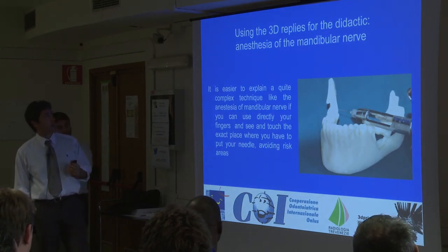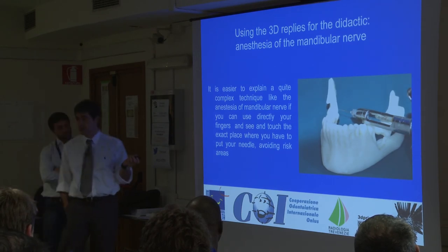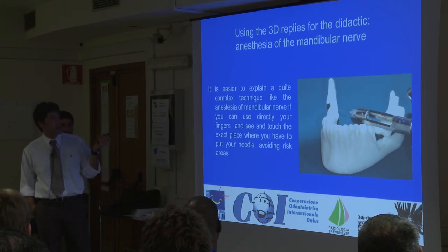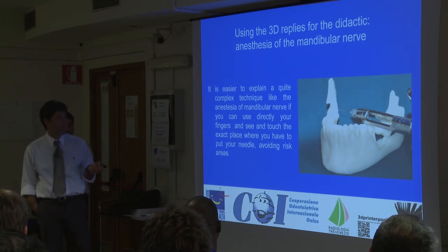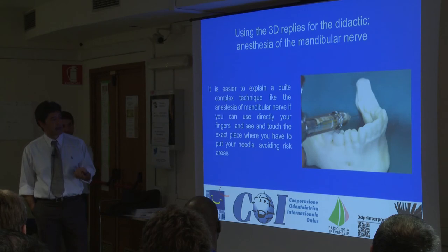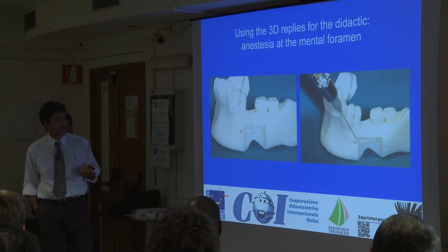When I go abroad, I use these replicas, because they are not expensive, for teaching my colleagues. It's easier to explain a quite complex technique like the anesthesia of the mandibular nerve if you can directly use your fingers and see and touch the exact place where you have to put the tip of your needle, avoiding dangerous areas. This is the same concept on the other side, or for the anesthesia at the mental foramen.